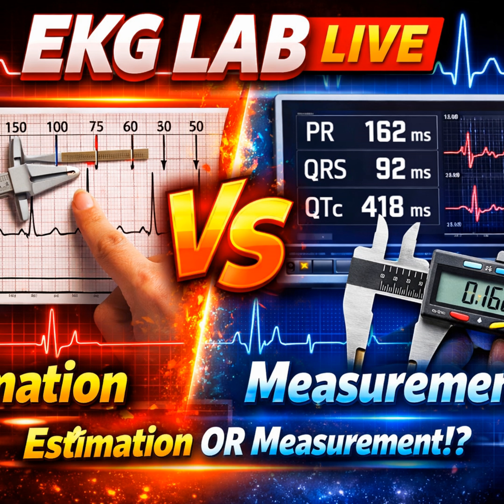That is an estimation. It is a shortcut. And while shortcuts have their place, they are dangerous foundations for a diagnostic framework. Let's dig deeper into where estimation fails. Let's talk about the mathematics of the pause. Ah, sick sinus syndrome. Exactly. We see this often: alternating tachycardia, bradycardia, and then sinus arrest.